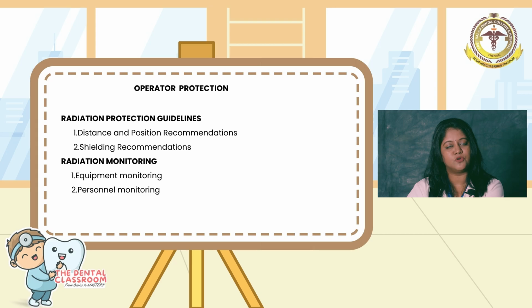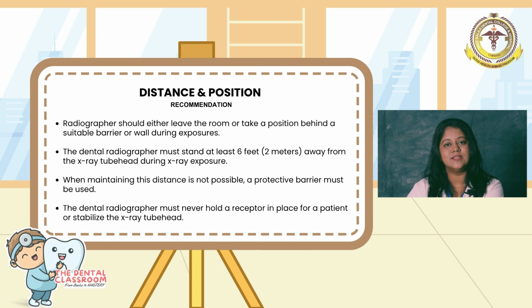So there are radiation protection guidelines for distance and position recommendation and shielding recommendation, and there is radiation monitoring for the equipment and personal monitoring. First, let's see what is the distance position recommendation.